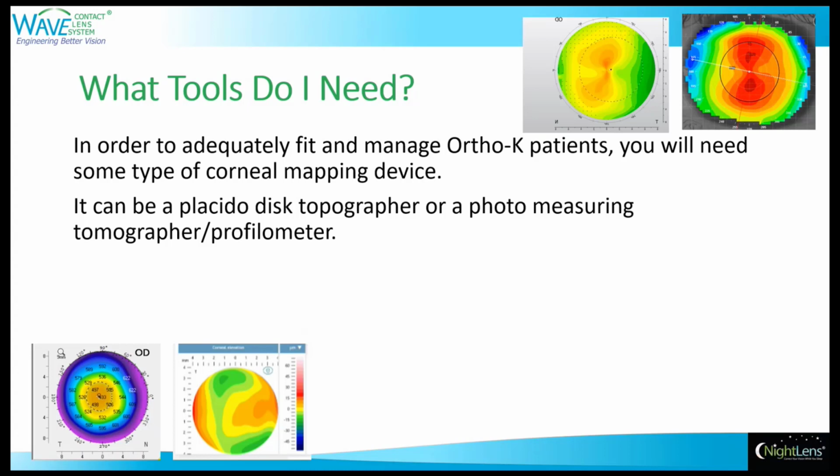Now, these instruments are very different. The Placido disc topographer relies on reflections of the rings in the Placido disc to reflect off of the tear layer in order to collect the data on the cornea. The tomographer or profilometer doesn't rely on reflections of the tear layer.